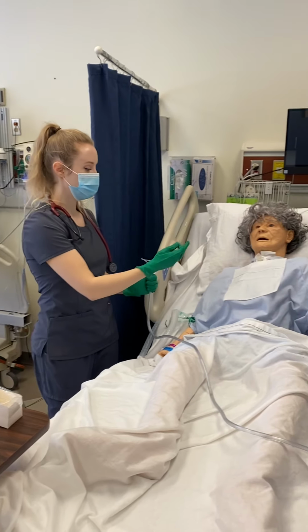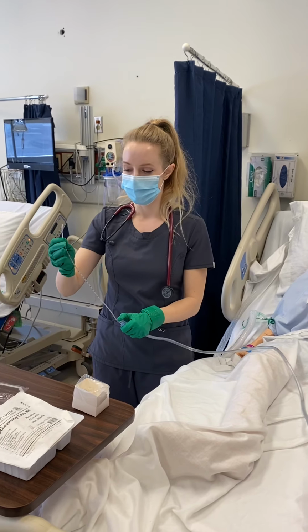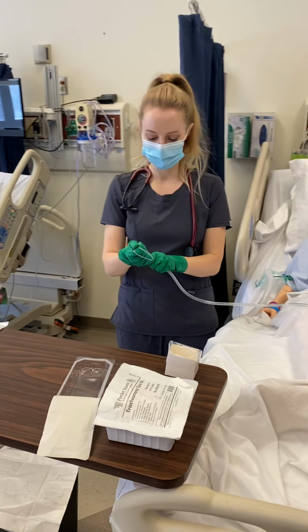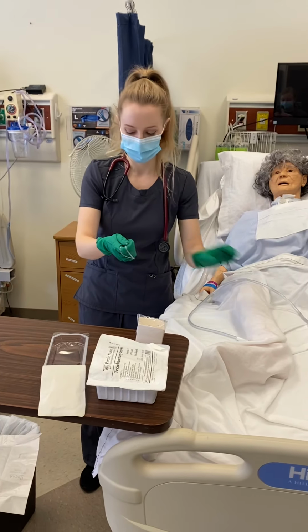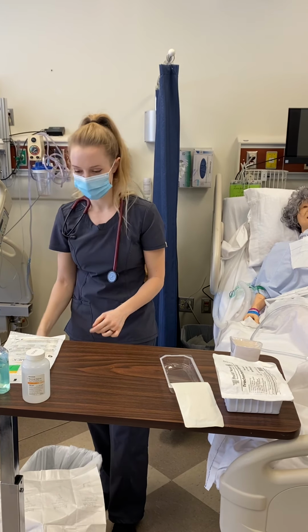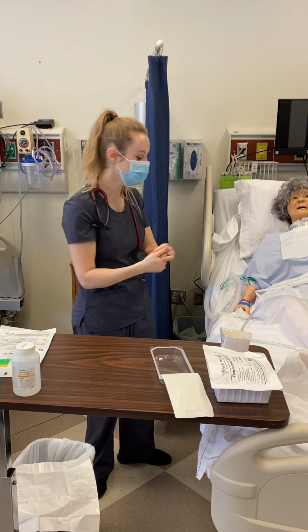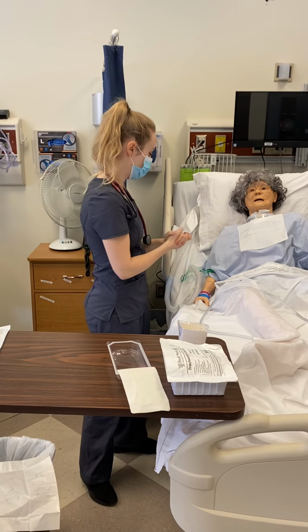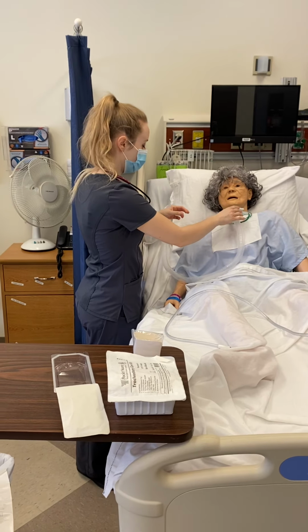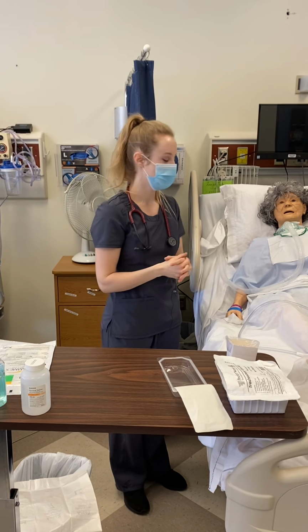Now that I have suctioned their tracheostomy secretions, I will wrap the catheter and dispose, and perform hand hygiene, and make sure my patient's oxygen level is back up to normal, and we want that above 92%.